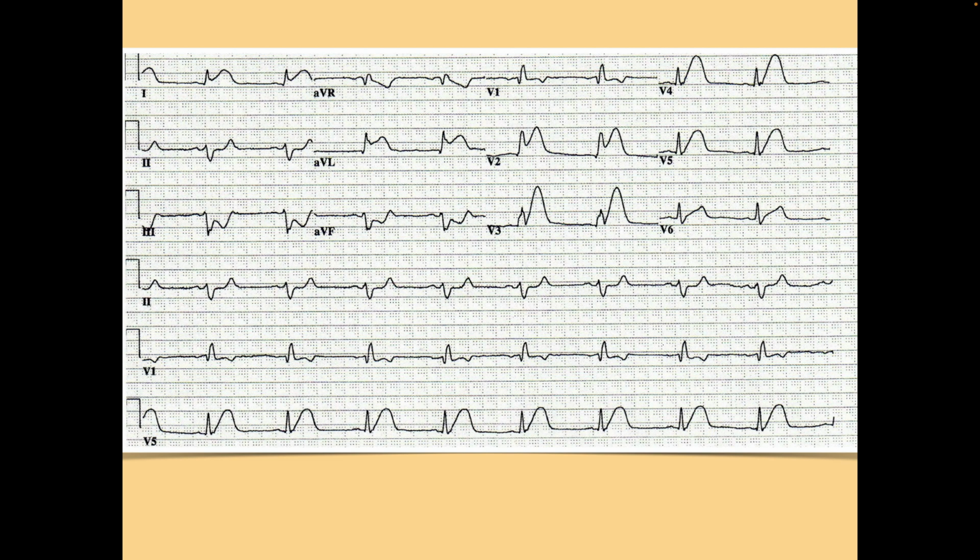Lateral. Okay. And so if you were to say to me there's a lateral STEMI here, and I say to you, what's the evidence? Initially, you would say, well, I have ST elevation in 1 and aVL. Is there further evidence for the lateral? Yes. What is it? You can see reciprocal depression in the inferior leads. Good enough right there. So this is a cath lab patient, right? Everybody in agreement?